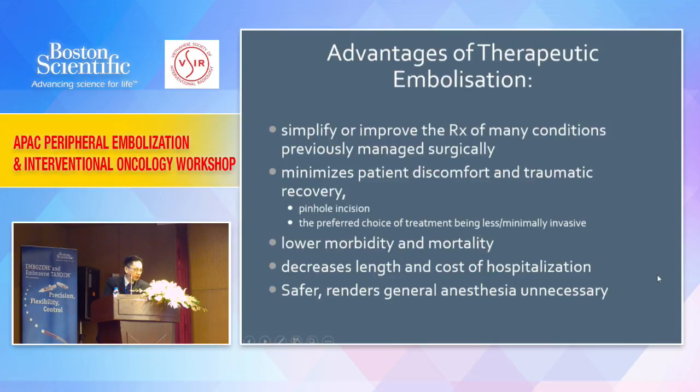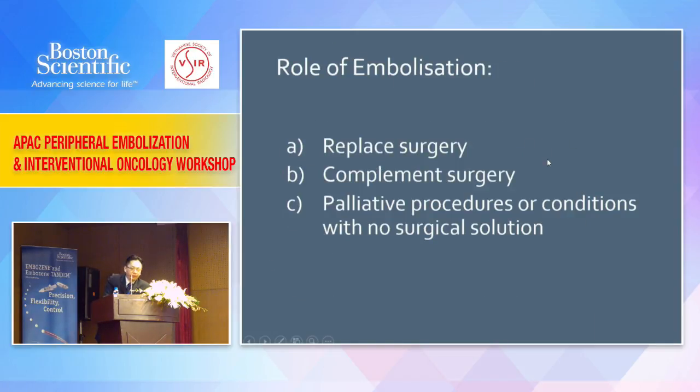the preferred choice of treatment being less invasive or minimally invasive. Yes, lower morbidity and mortality. It decreases length of stay and hospitalization costs, and is safer. You don't need general anesthesia. Many advantages. And the role of embolization also encompasses 3 main subcategories.